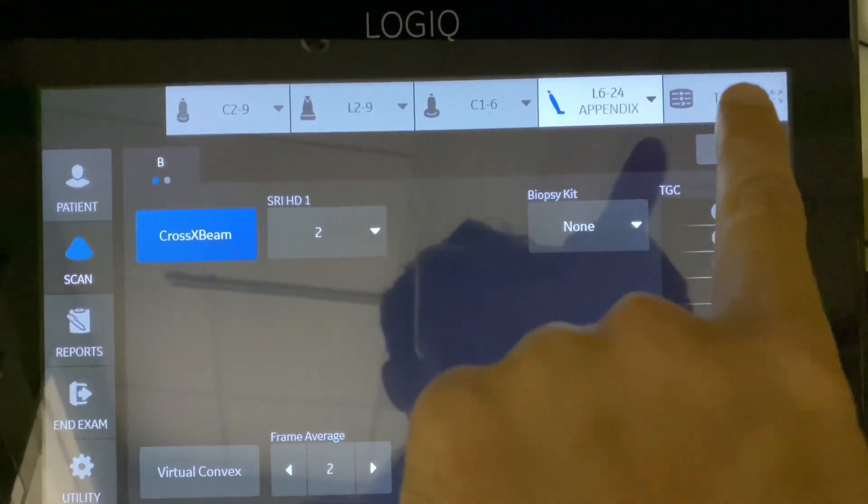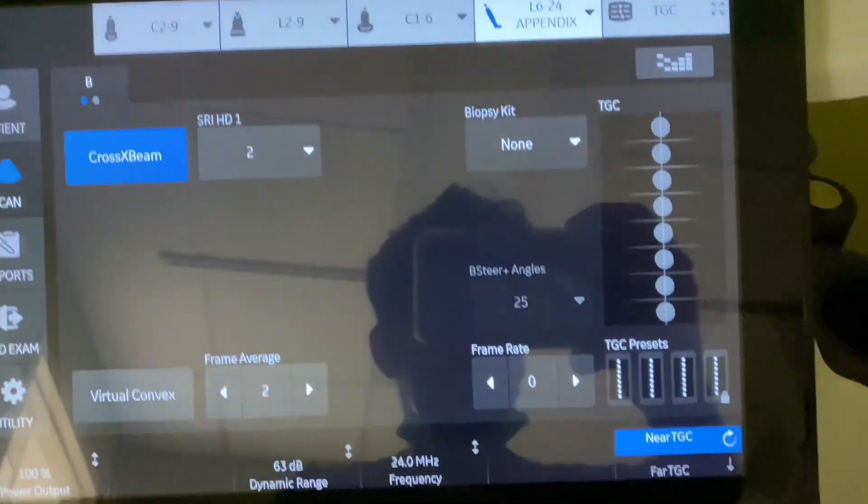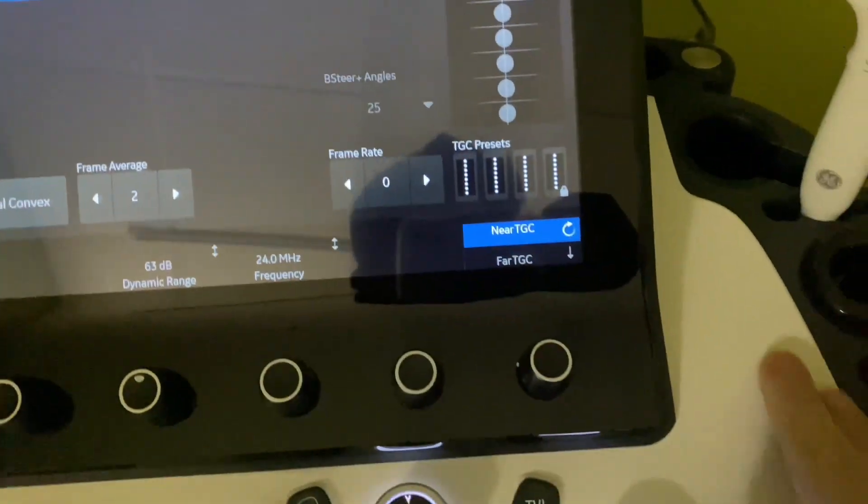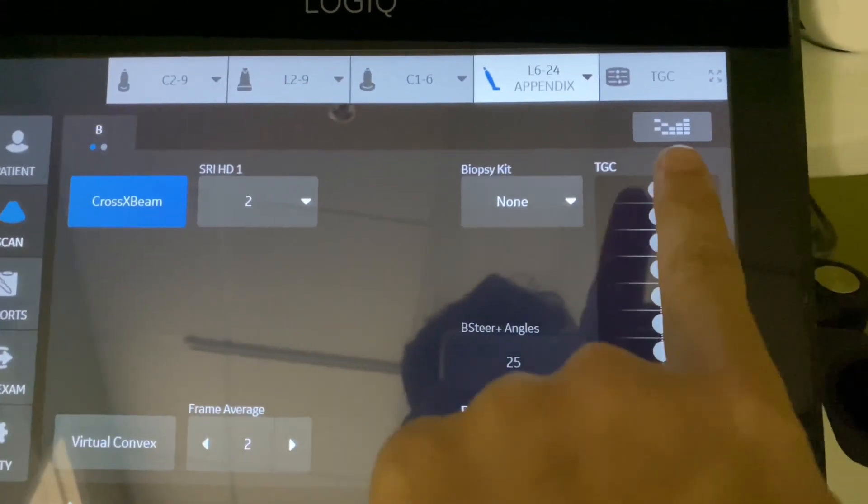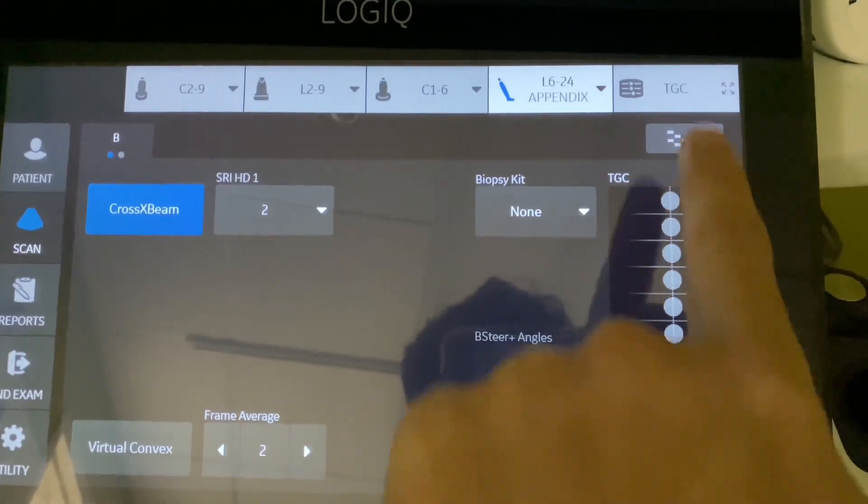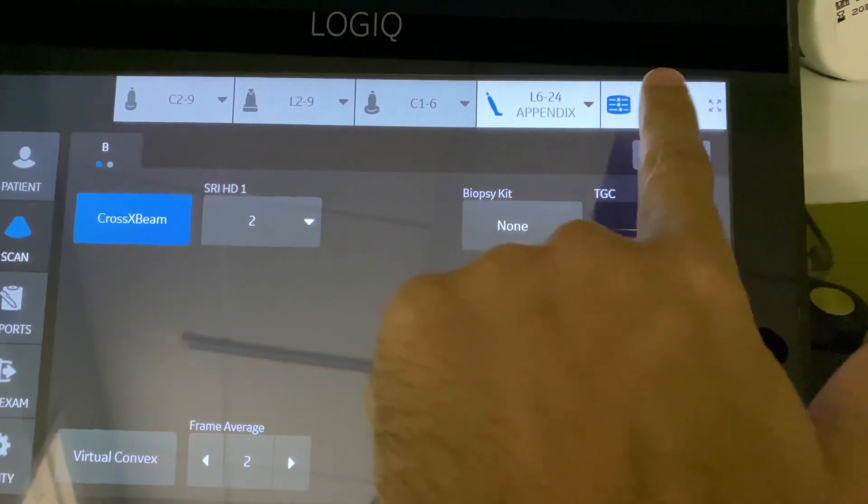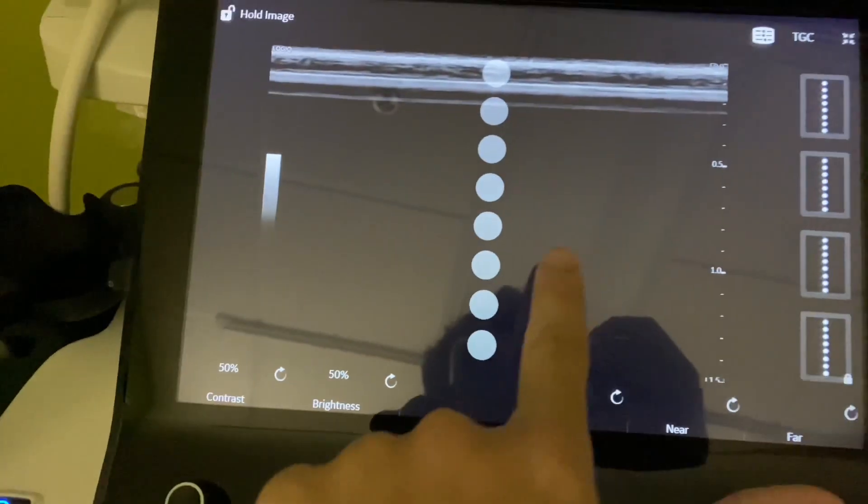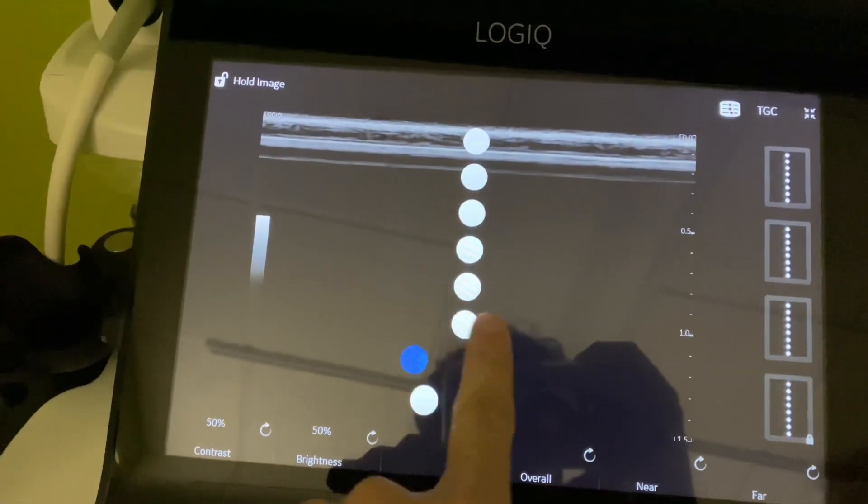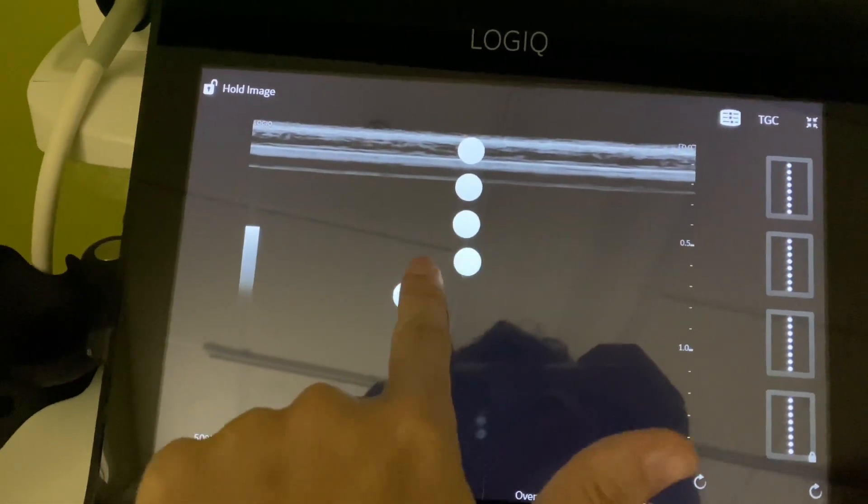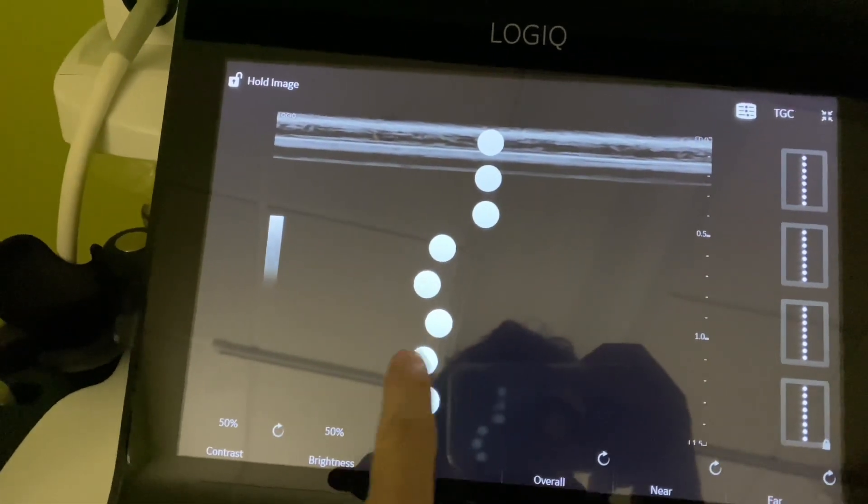What I don't like about this new machine is that it doesn't have the external TGC buttons. It has a slide here, so you click on here and you can adjust the TGCs this way. I don't like it.